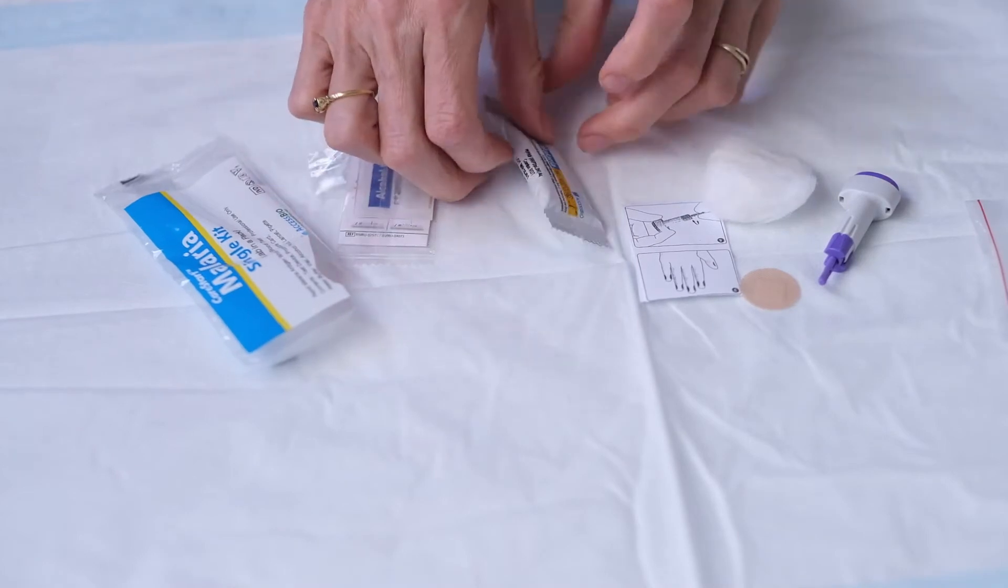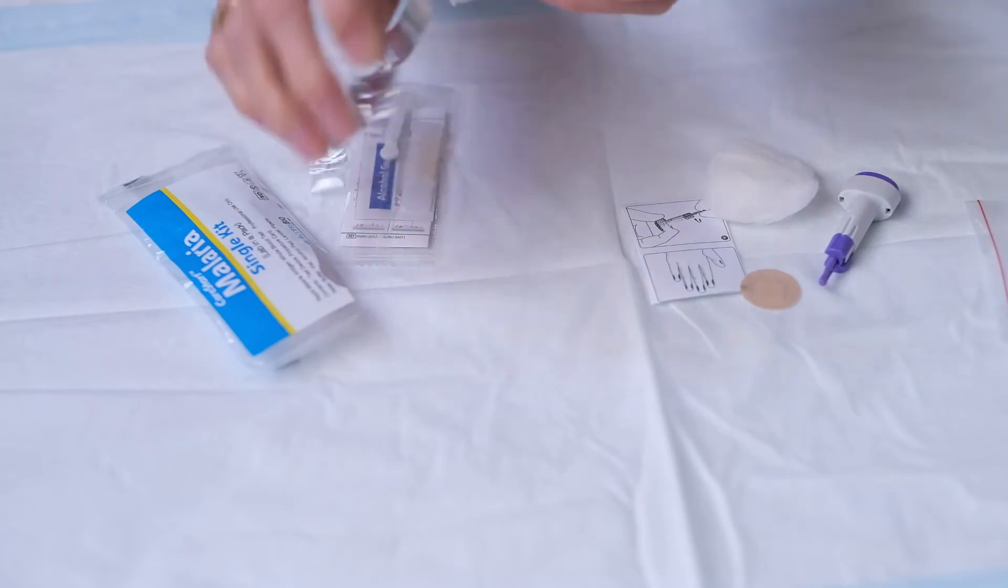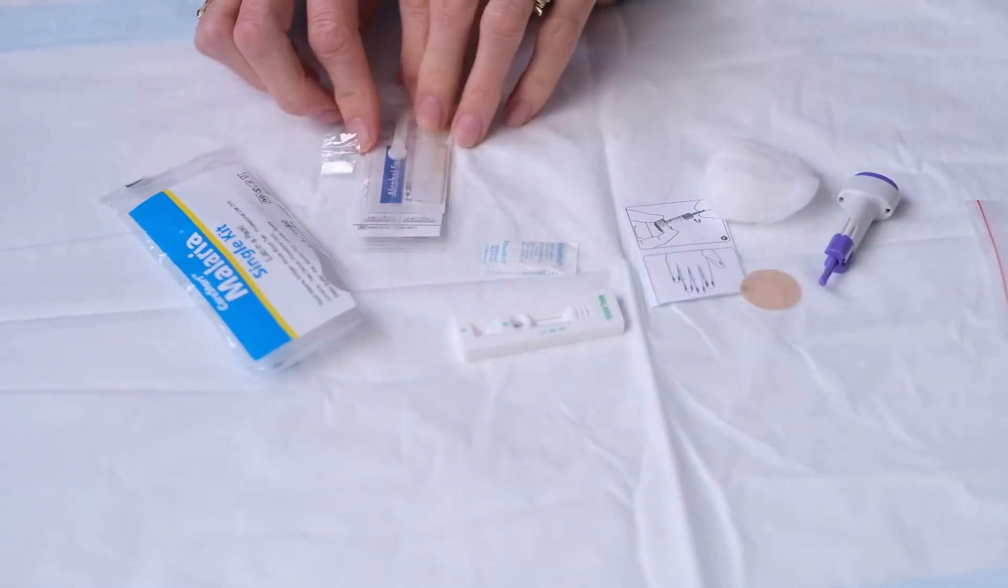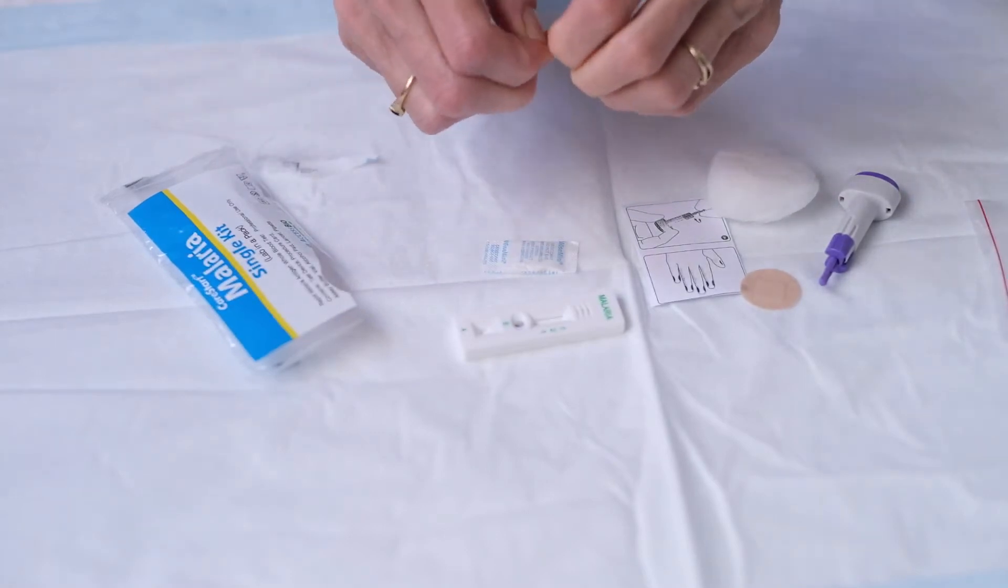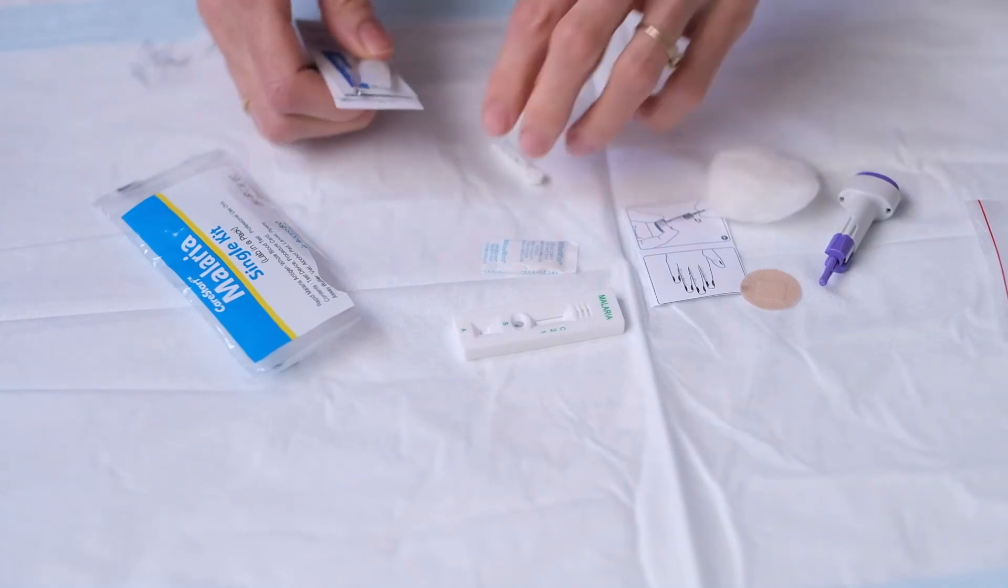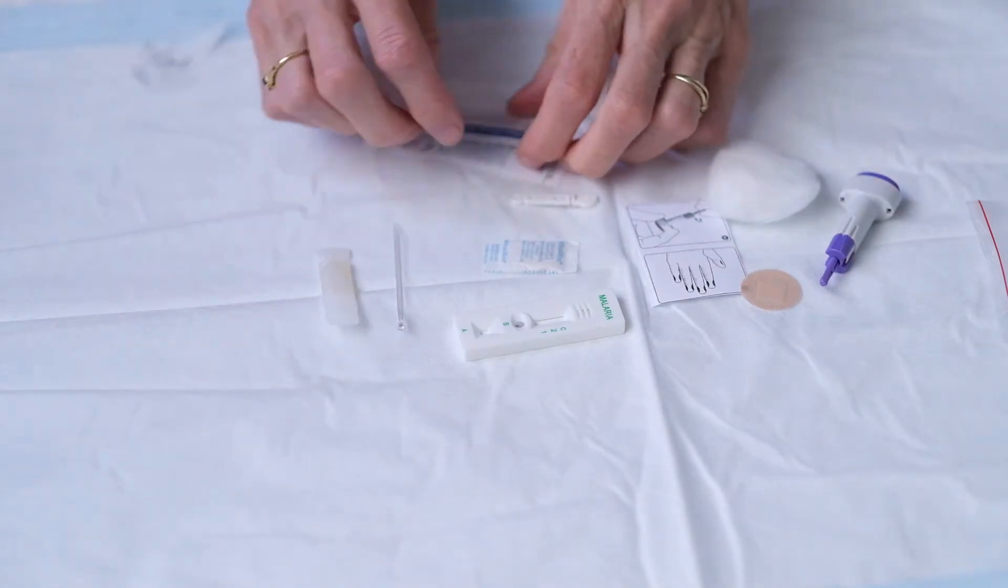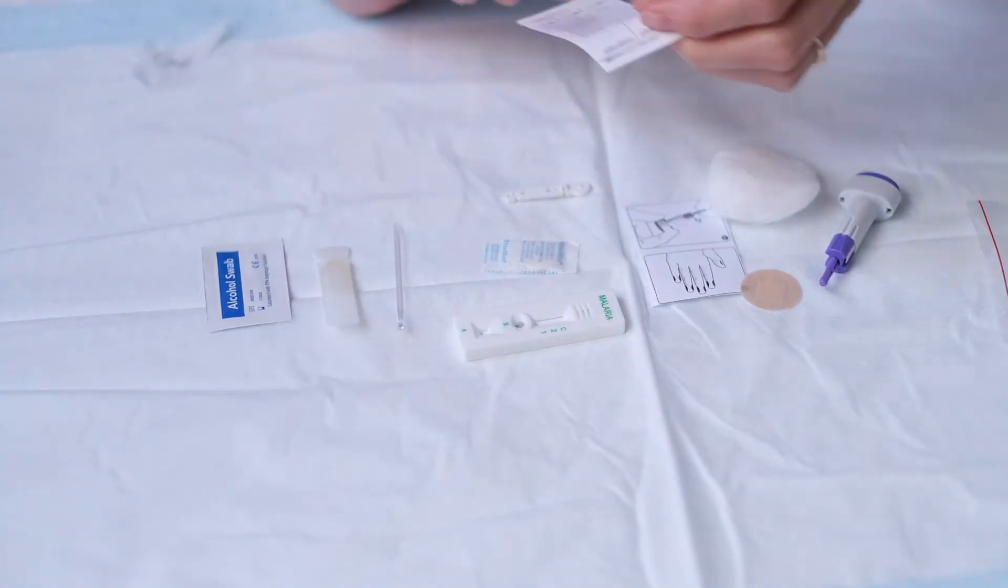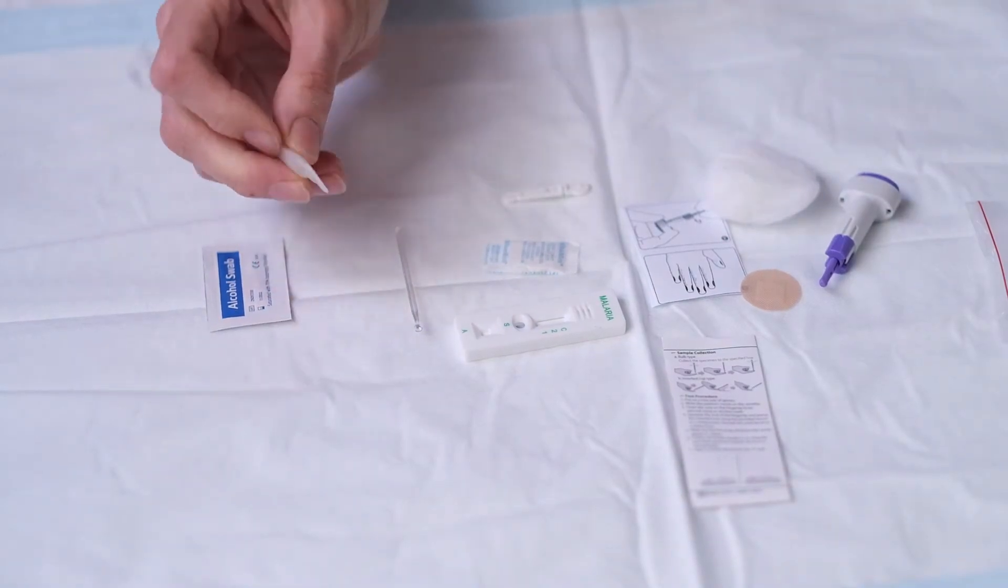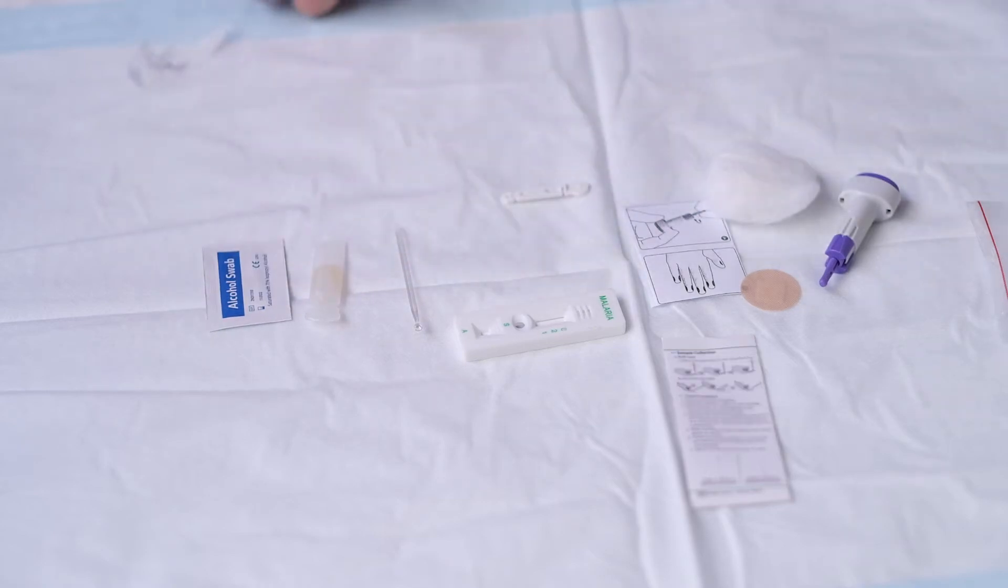So we have the little cassette and another inner packet. It's a bit like Russian dolls. So you can see here all the contents. We've got some more instructions. This is the collection tool, the buffer, a little alco wipe, and this is a packaging device. So we'll chuck that away.